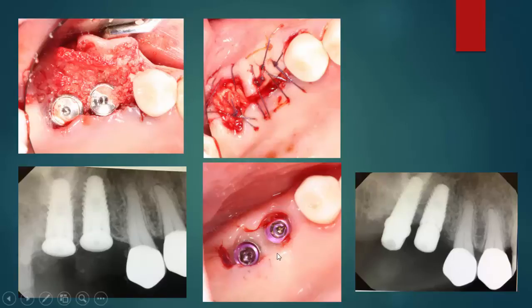This is a photo. طبعا عملت أنا شوية alveoplasty فمشان هيك ملاحظ البليدنج. And this is the X-ray after the stage 2. فبنلاحظ نحن هون ال apical part of the implant is covered by bone graft.